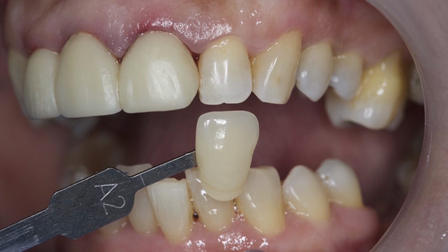It is important for a product such as BruxZir Anterior to take a picture of the prep with the stump shade in place and send it to the lab. In this case, since I felt like the underlying preparation would not change the outcome of the final color of the restoration, I only took the shade of the surrounding dentition.